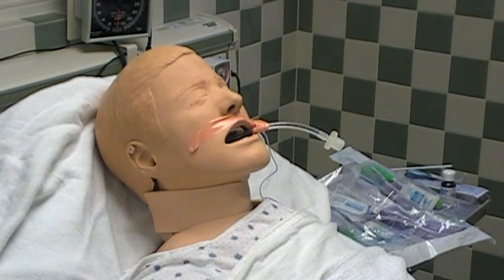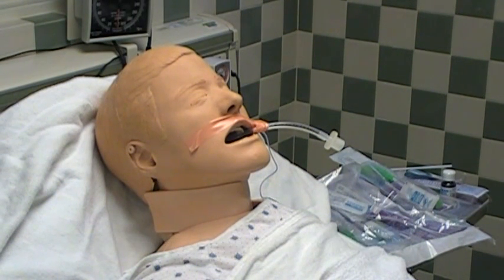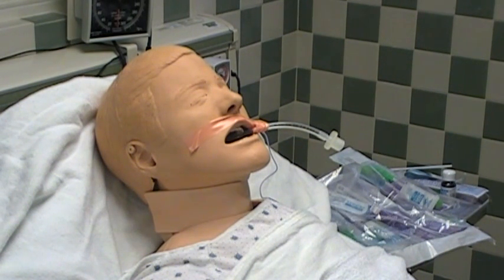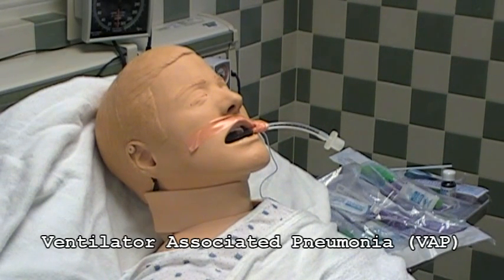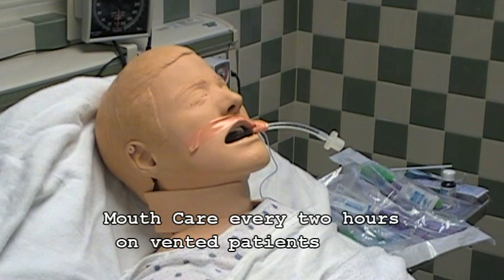We have Tyrone here as a patient care technician, and he is going to show us the preferred way to do mouth care on a patient with an artificial airway — anyone with an endotracheal tube or tracheostomy tube attached to a ventilator. Always remember bacteria is present in every patient's mouth, and doing mouth care gets rid of some of this harmful bacteria. If mouth care is not done, this bacteria mixes with the patient's saliva and drips down their throat into the lungs and can cause pneumonia. This pneumonia is also called ventilator-associated pneumonia, or VAP, and it can be deadly to patients who are already sick in the ICU. That's why we do mouth care every two hours.